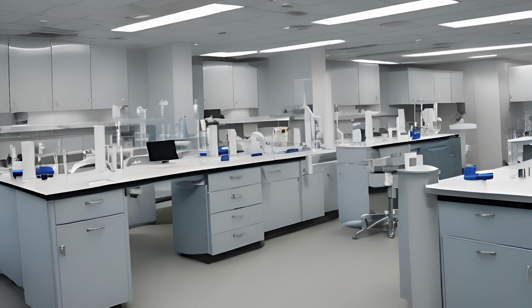An outpatient is typically going to be called into your phlebotomy area from the waiting room. Usually, for routine work, they're going to be called in on the order of arrival. Whoever checks in first gets seen first. That's standard practice. An outpatient is not usually going to have an ID band, but you still have to identify that person. The receptionist has likely already identified them when they checked in. Doesn't matter. You're going to ID them again.